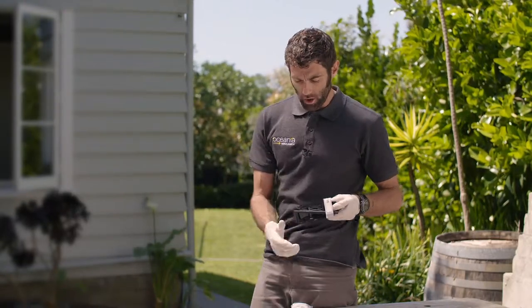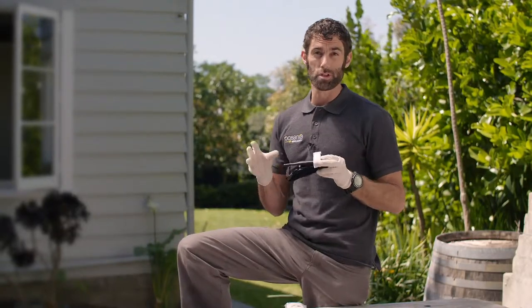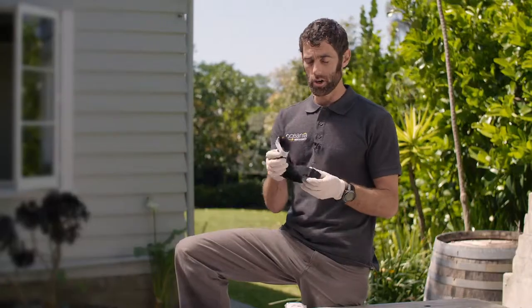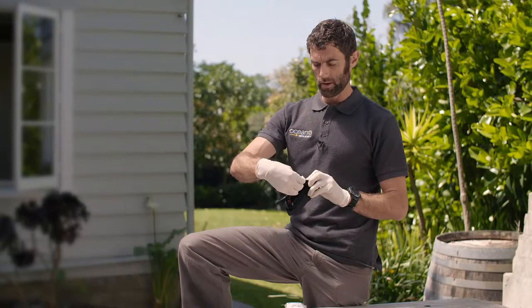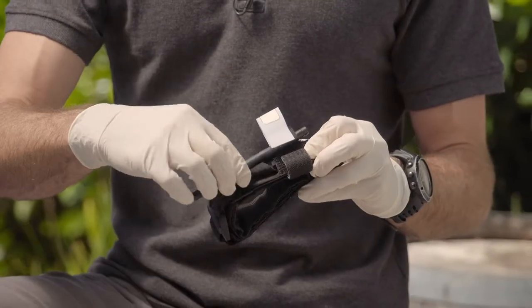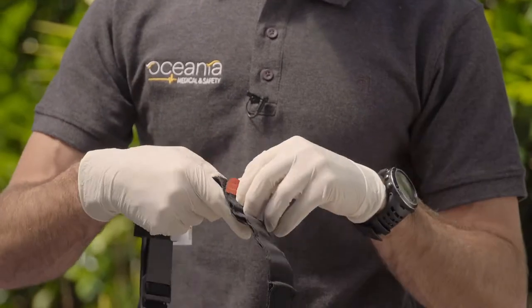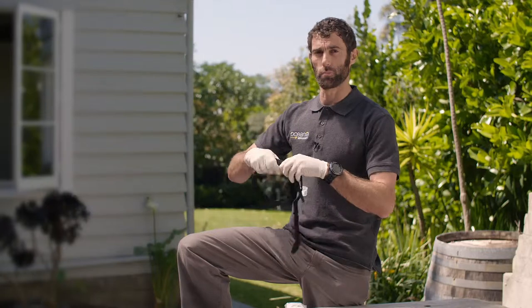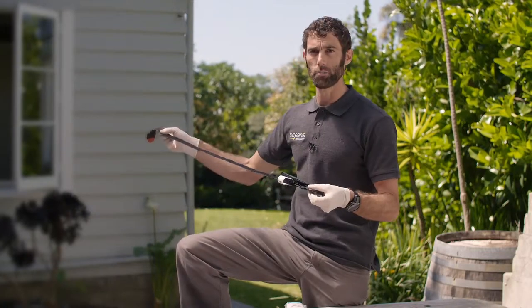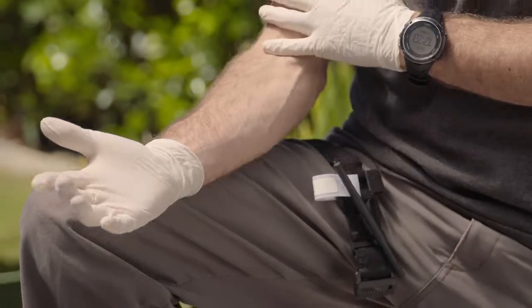When you open it out of its packet, we always say slow is smooth, smooth is fast — because there are a lot of intricate parts that can get tangled if you're not careful. Open it up, get the torsion bar ready so that you can tighten it. Extend it out as much as you need to, and with a real injury it's easiest if you completely undo it to put onto the casualty. With a limb — arm or leg — put it up high and put it on tight.